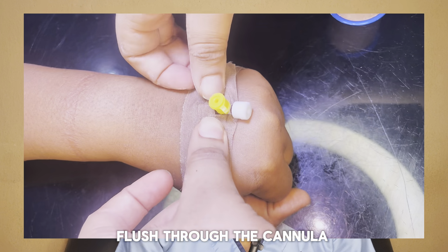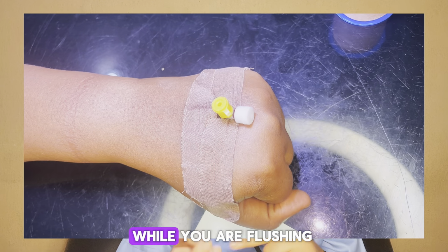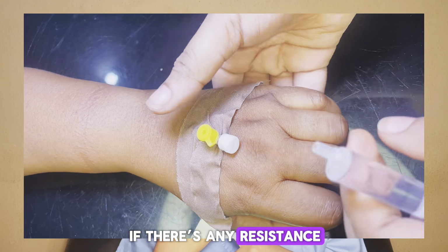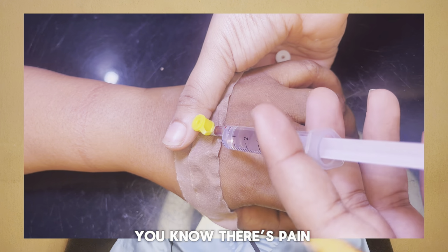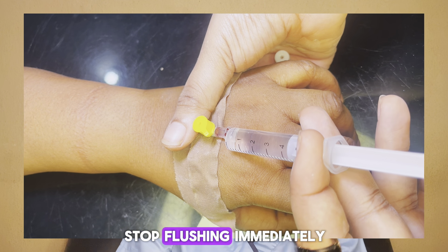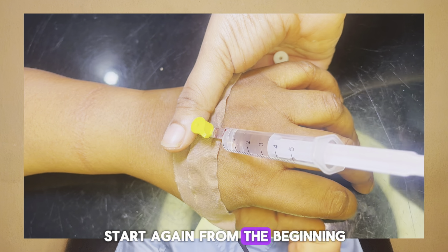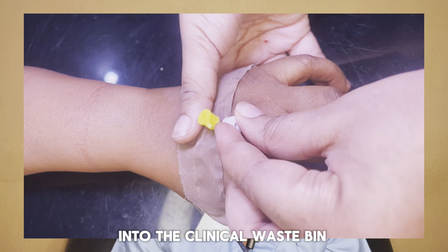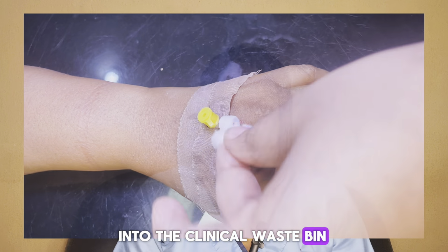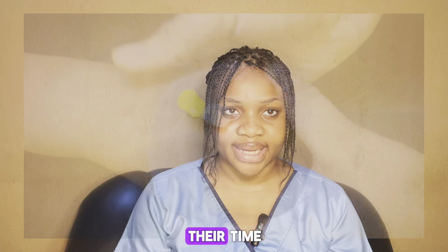Flush through the cannula with the saline that you withdrew earlier. While you are flushing, if there's any resistance, like it can't go in, or there is pain or there is swelling, stop flushing immediately. Remove the cannula and start again from the beginning. Dispose of gloves and the equipment into the clinical waste bin if you were successful. Let the patient know that you are finished and thank the patient for their time.